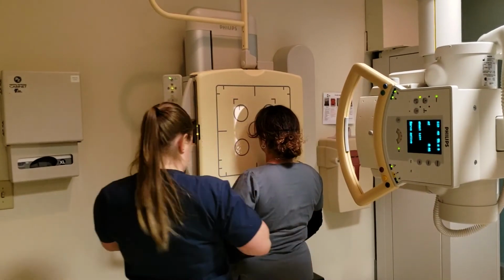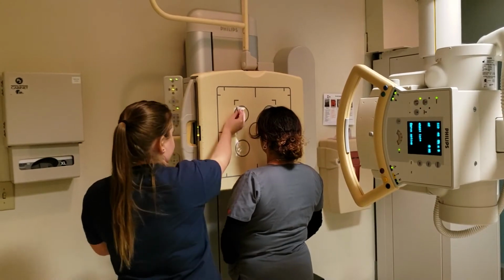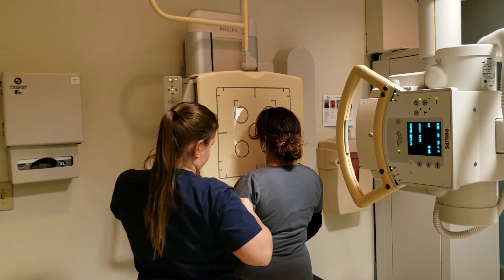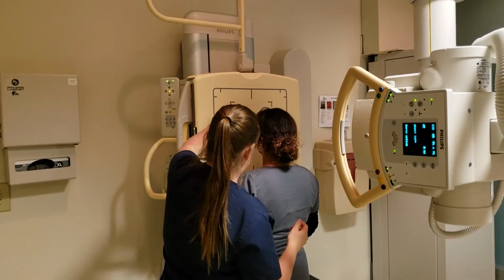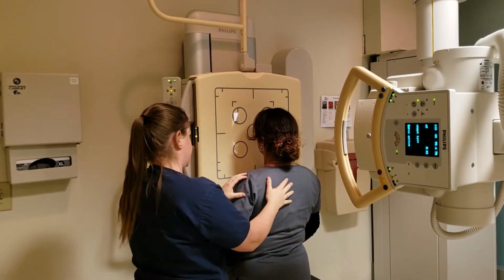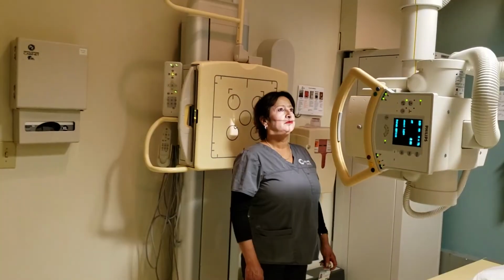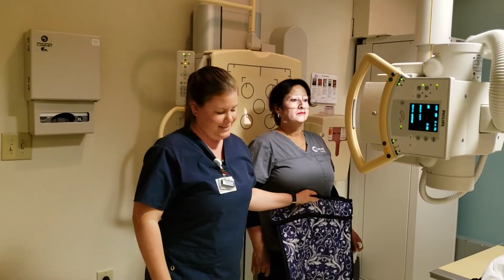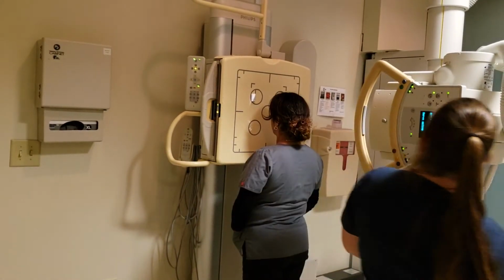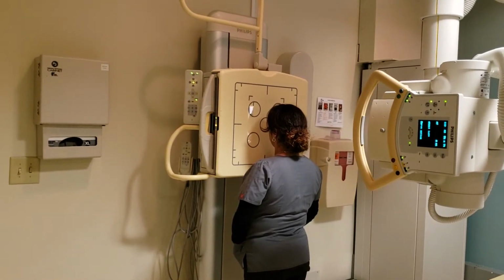Cone in a little, and then my left marker here. Alright, so I'll hold nice and still. Throughout all of them, she's been wearing this shield. And I'll have her hold her breath again, take the x-ray, you can breathe.